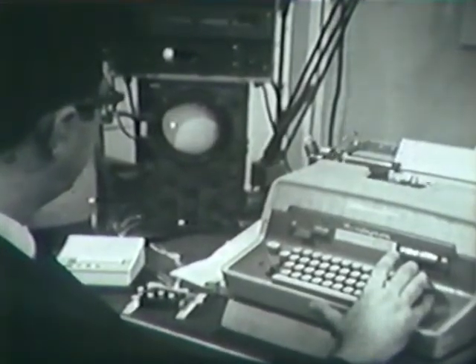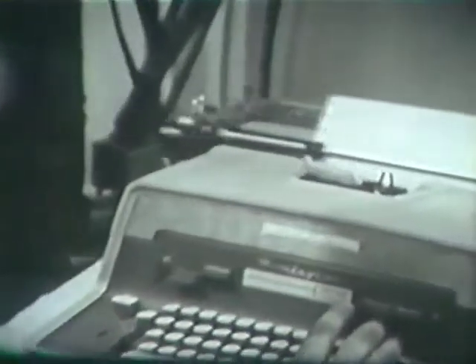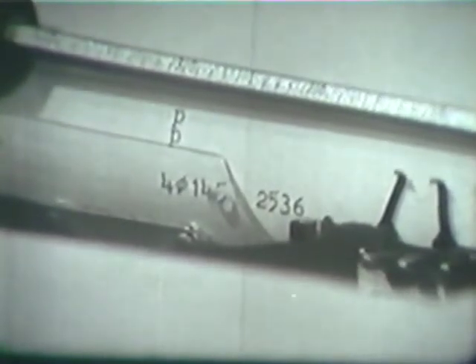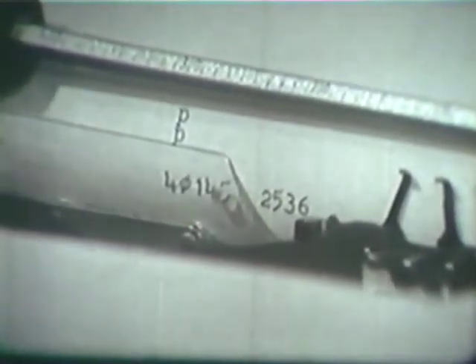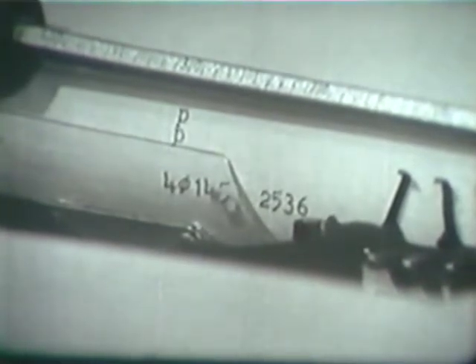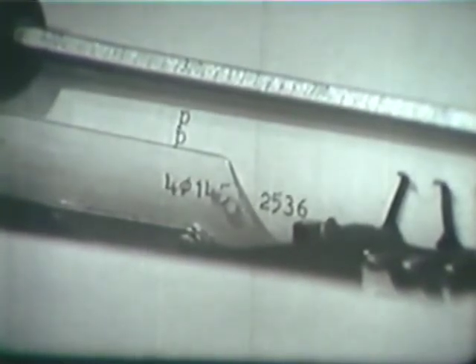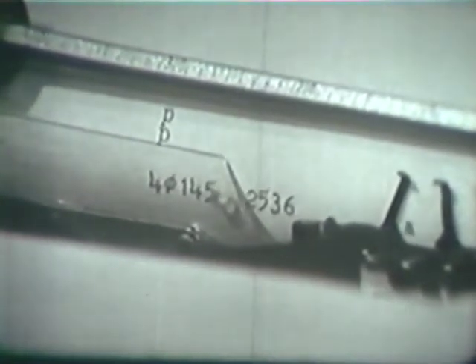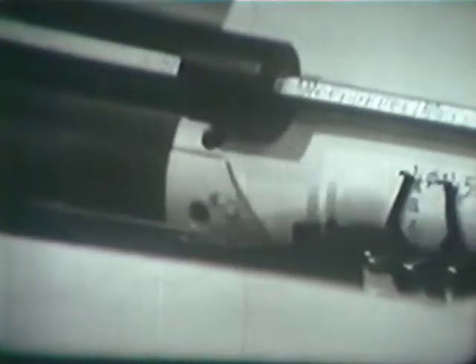We're going through a preliminary setup mode. It traced the letter A and generated a code word here, 401452536. Now, those aren't just ones and zeros. Yeah, well, that's a different kind of coding. That's called an octal coding, and each of those numbers represents a group of three ones and zeros. Oh, I see. For instance, if it were 111, it would write 7. Okay. It's binary coding.